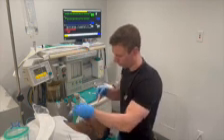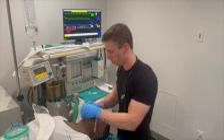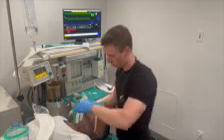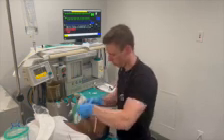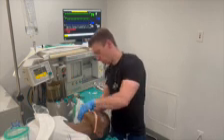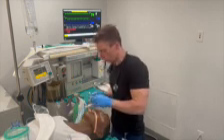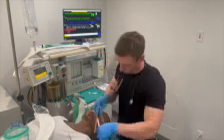Often the ET tube is taped on the right side and situated within the paraglossal groove, which is between the molars and the lateral aspect of the tongue. Start the tape on the lower end of the mandible on the left side. Make a loop around the tube, covering the number that you want the tube to remain at. Then continue to the other side of the mandible. It is prudent to lay down one more strip of tape over the initial piece for good measure.